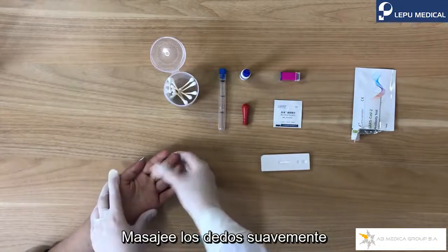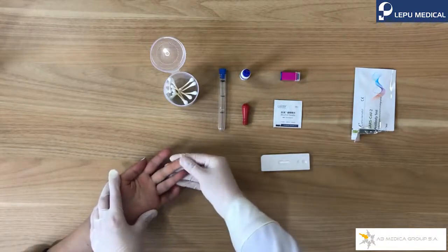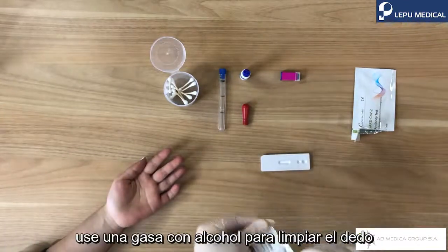Massage the finger smoothly. Use the alcohol swab to clean the finger.